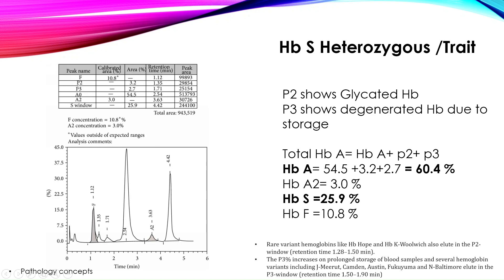Now let's see HbS heterozygous, or sickle cell trait. Here an additional peak is observed in the S window at retention time 4.42. HbA is around 60%, HbA2 is 3%, HbS is 25.9%, and HbF is 10.8%. In sickle cell trait, the percentage of hemoglobin S is between 20 to 30%.